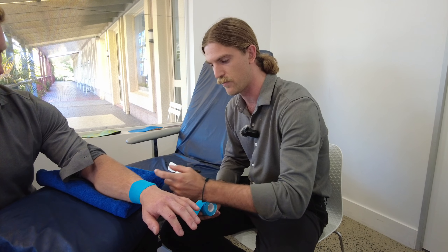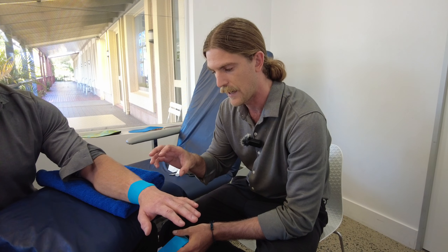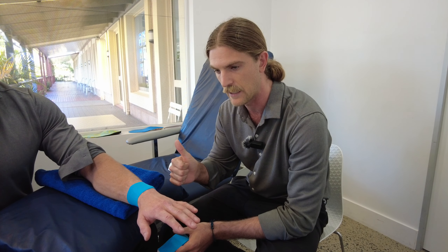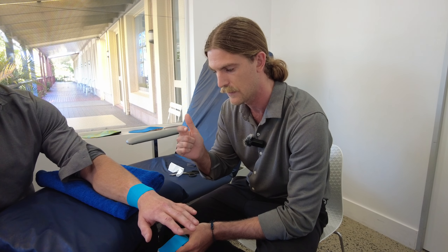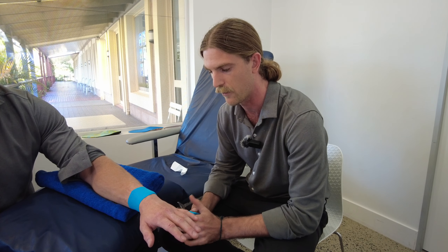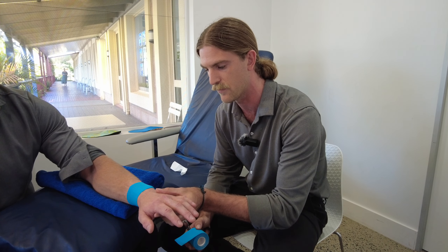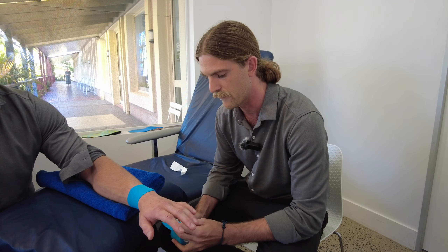Before administering the tape, we've gone through all our warnings and contraindications. If they've had any reactions to tape previously, or if it feels swollen, throbbing, or there are pins and needles — any of those really bad symptoms — we're just going to take the tape back off. Once they're feeling good, they can keep it on for at least three days to provide support through the wrist.